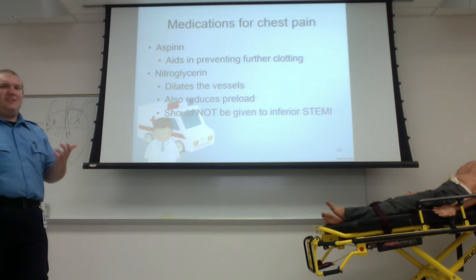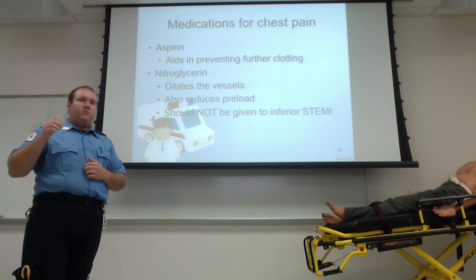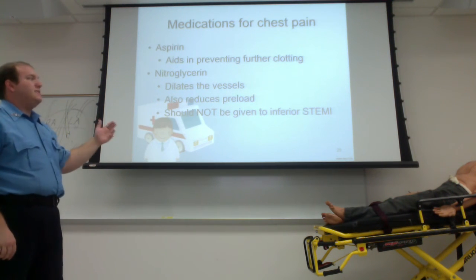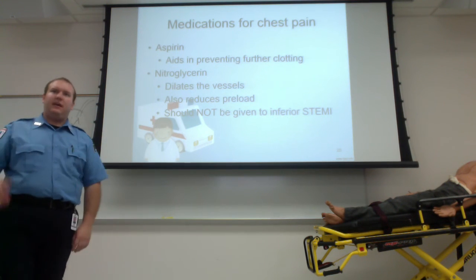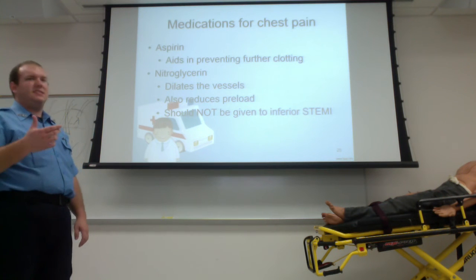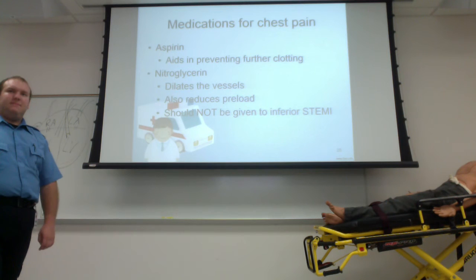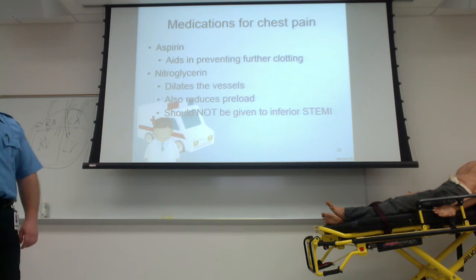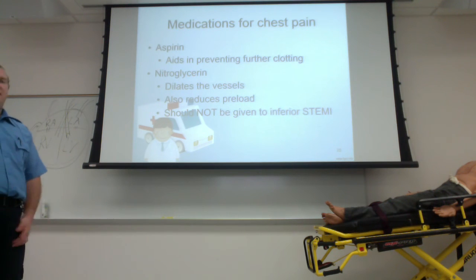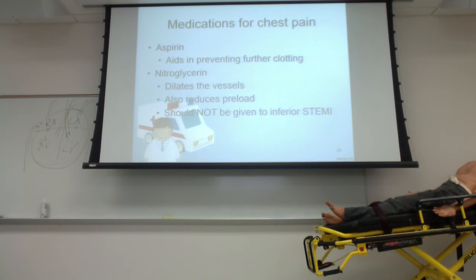I know you can't read an EKG at the basic level, but if you want to be an extra achiever and say, oh look, I believe this patient's having an inferior STEMI, I think I want to hold off on this nitro until the paramedic crew gets here and looks at this a little deeper. I'd say go for it. I wouldn't have a single problem with that. If your paramedic crew's only 5 minutes out, 5 minutes of giving that nitro is not going to make that big a difference at that point. Especially if you're suspecting that inferior STEMI.